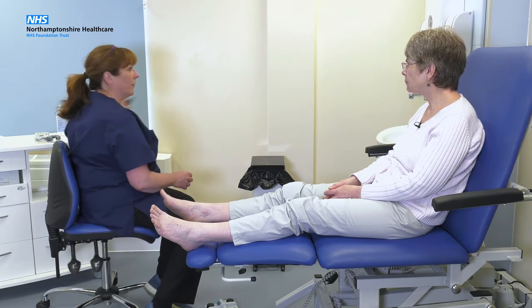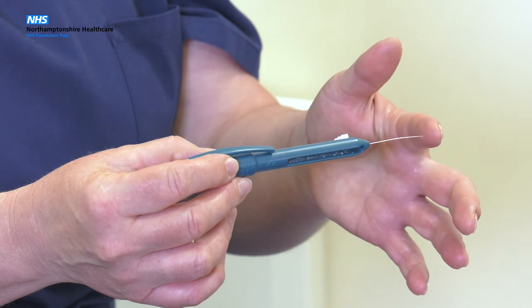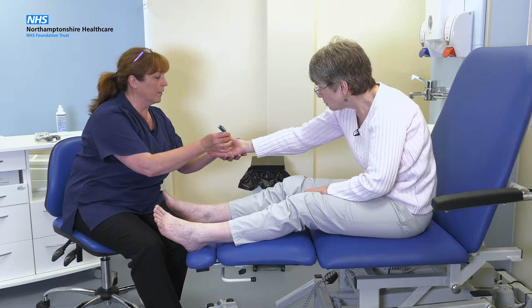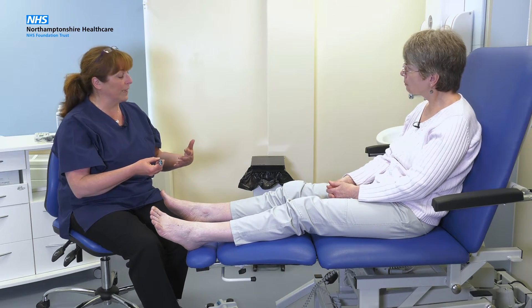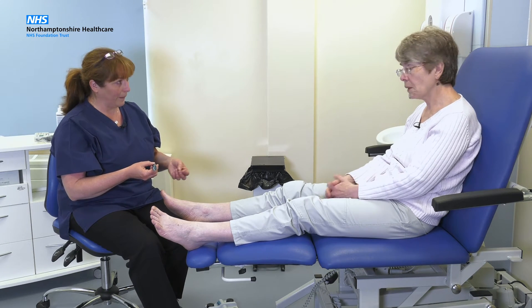We're going to do your annual foot screen today, looking at the sensation in your feet and later the circulation and blood flow to your foot. I'm going to be using a 10 gram monofilament to find out whether or not you've lost any sensation in your skin. It looks a little bit like a needle but it's a soft plastic fibre which won't cause any pain, but you will be able to feel a light touch sensation from it. I'll just demonstrate to you what that feels like on your hand. You may or may not get the same level of sensation in your foot — that's actually what we're testing. Are you happy for me to carry on? Yeah, that's fine by me.